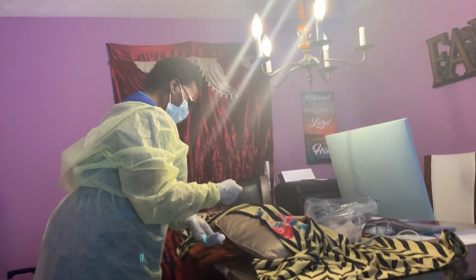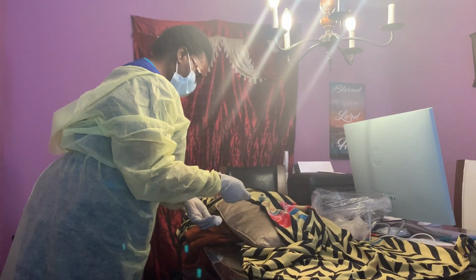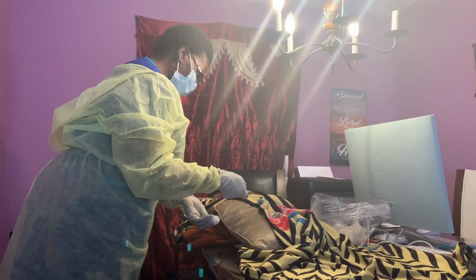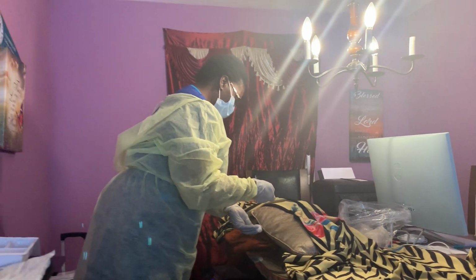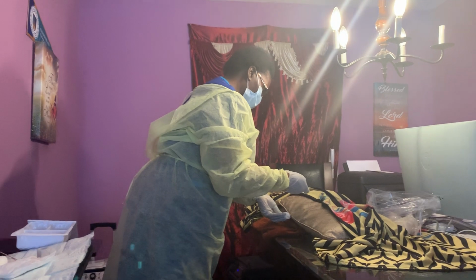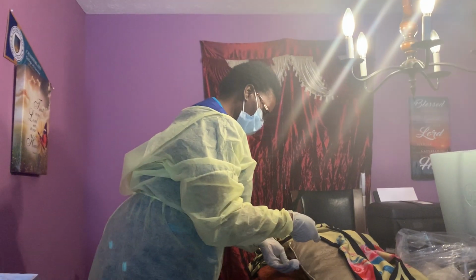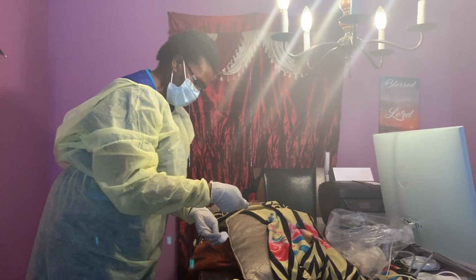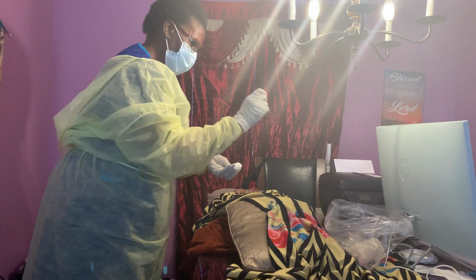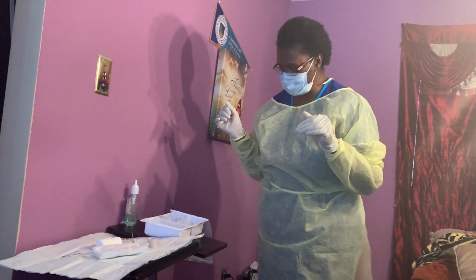So with my gauze on the side, just making sure that the irrigation is right inside the wound, not touching outside of the skin. And then this gauze is used just to help. I have my absorbent pad already there, but just to make sure the patient is not wet or messed up. So now that is done, I'm gonna trash both the sterile gauze and this in the trash receptacle.